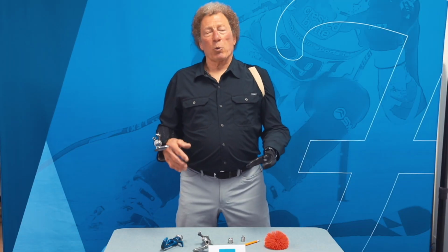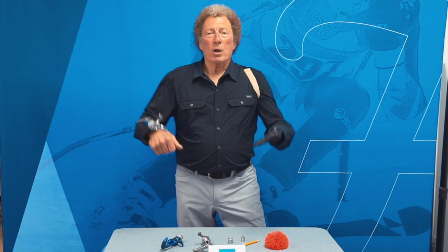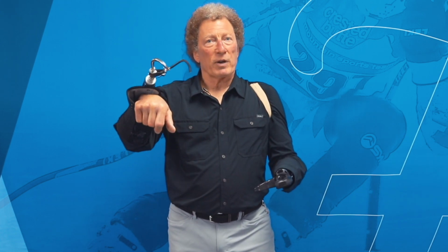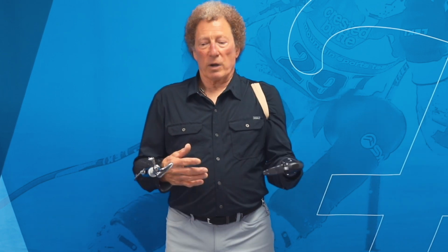They both work in the same way in regards to the body motions that you use to operate them. These are all cable-operated devices. So glenohumeral flexion, extension of your arm, creates excursion and pulls on the cable in both cases. In one case, it pulls the device open. In the other case, it pulls the device closed. You also have scapular abduction, whether unilateral or bilateral. That creates, again, excursion and tension in the cable, either opening or closing the device.